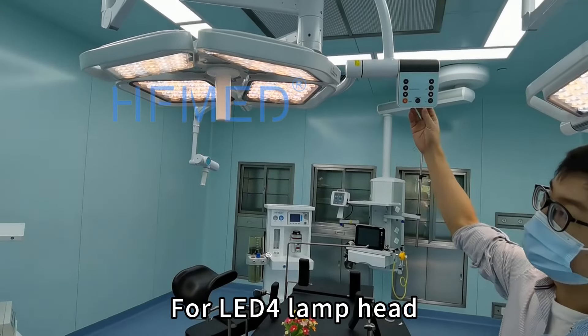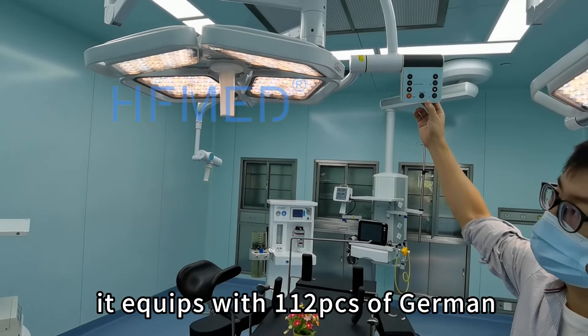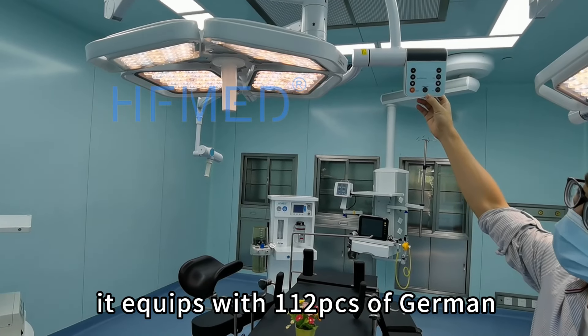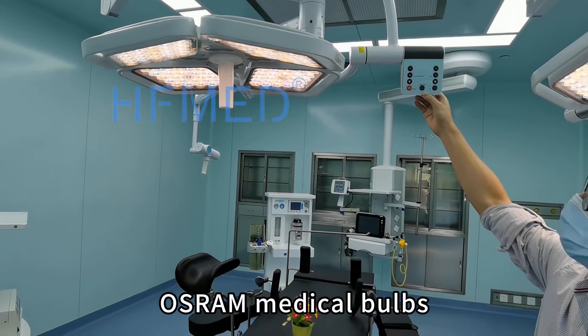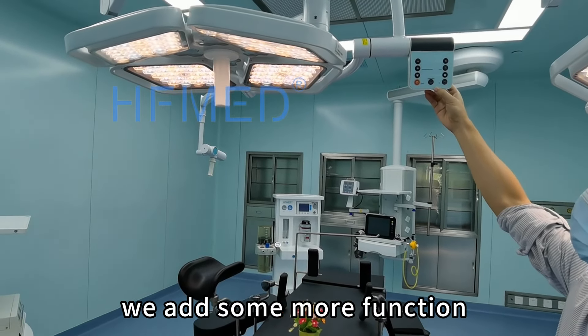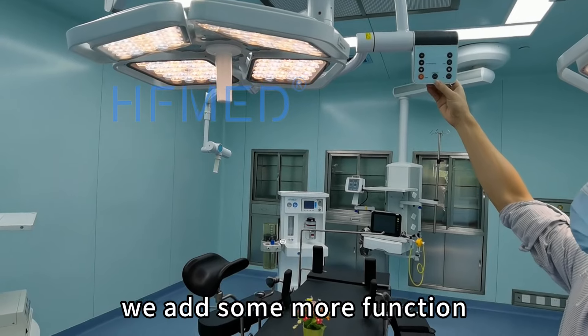For the LED4 lamp head, it is equipped with 112 pieces of German Osram LED micro bulbs. And compared with LED3, we have added more functions for this lamp.